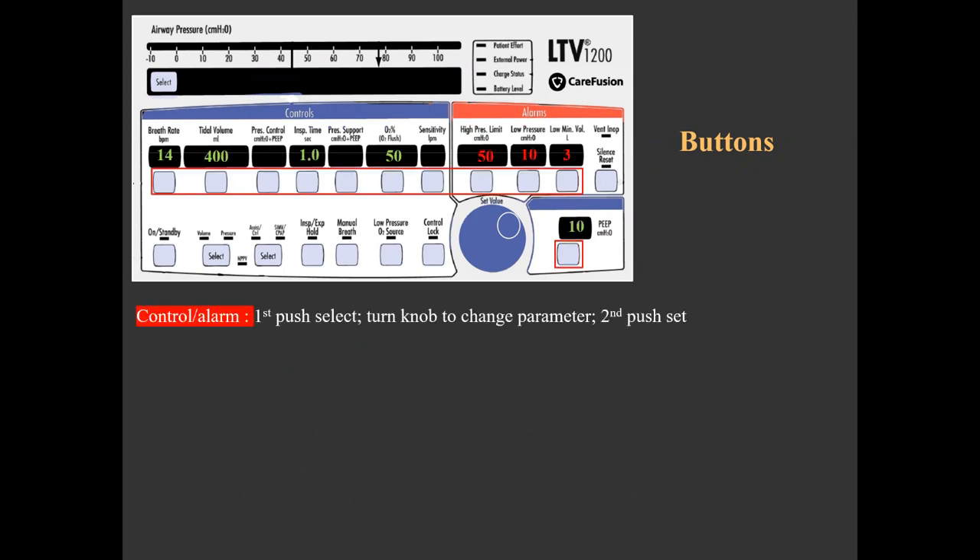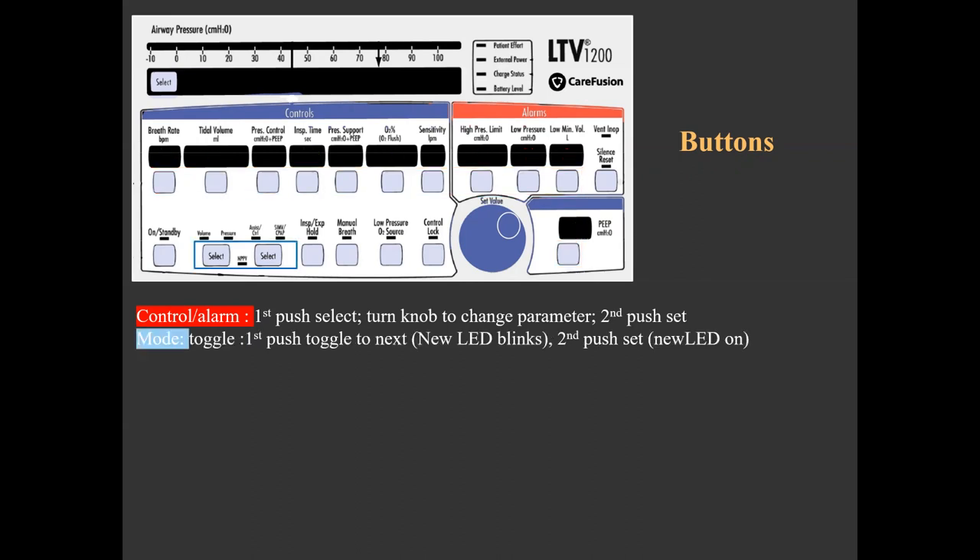Upon selecting a control button, its associated display becomes bright while all other displays dim. At this point, the value toggle knob can be rotated clockwise or counterclockwise to change the selected parameter. Once done, the button is used to set the parameter and all active displays become bright again. The main display control button is used to set optional extended features that do not have their own display.